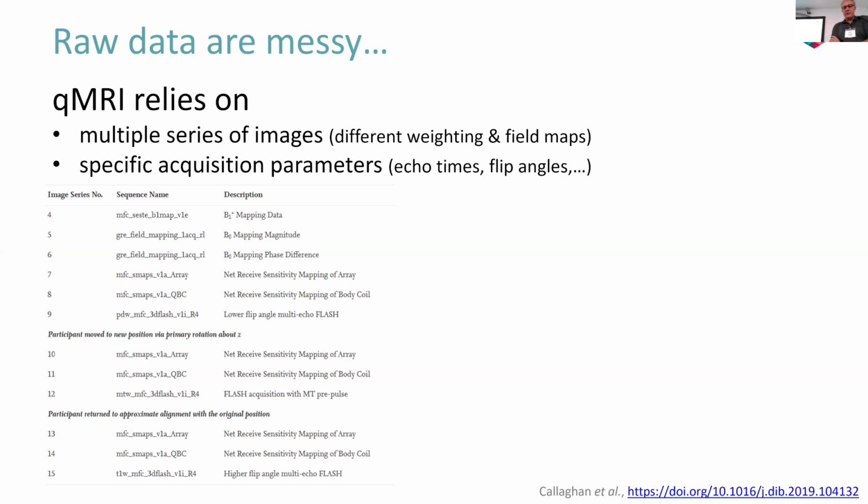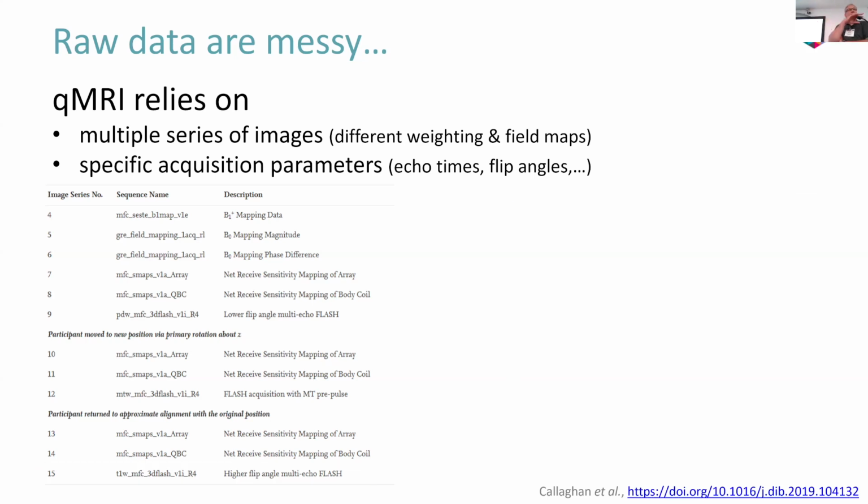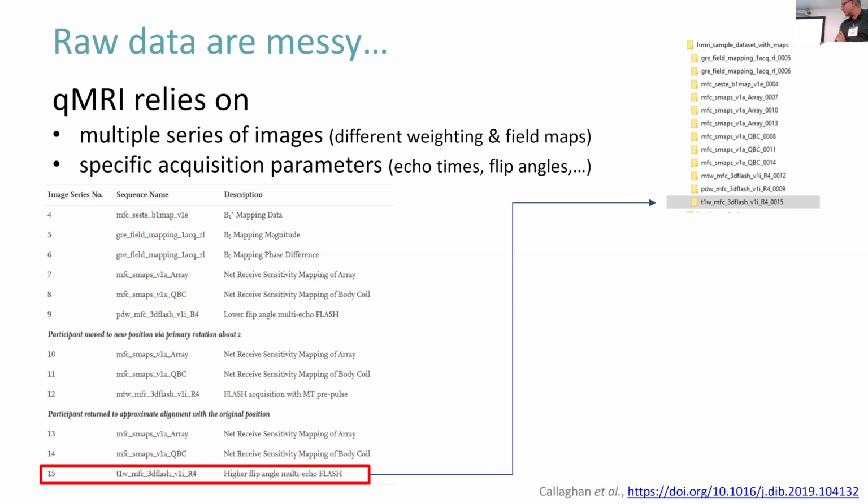of all those data. So that's actually the cool thing, the code is open. There is an example data set available. So this is from the example data set. If you look at what you get, 12 folders, each containing a bunch of images.